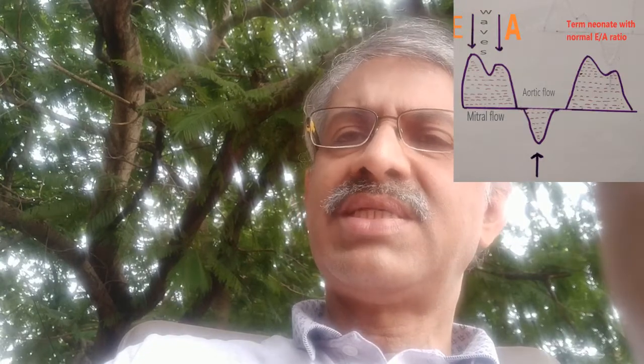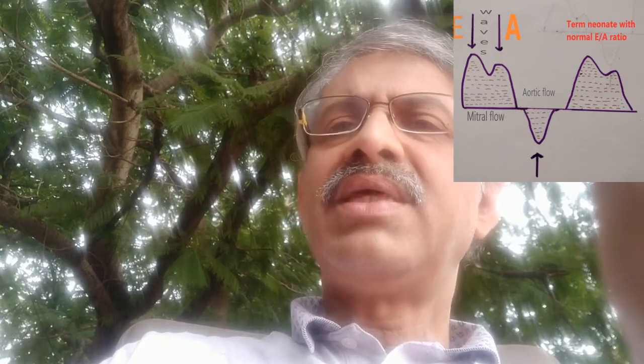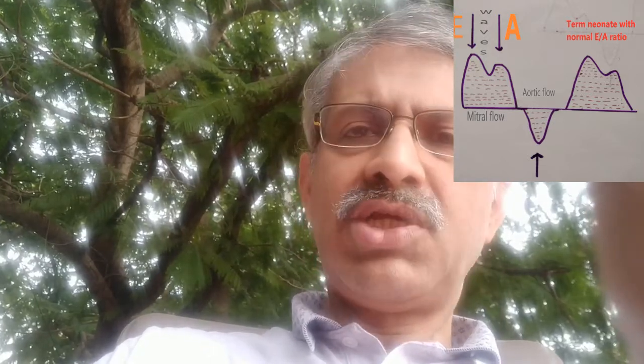In term neonates, because the diastolic function is well developed, the majority of the blood enters into the left ventricle in the early phase. Only a small amount requires the left atrial contraction to push the blood into the left ventricle. So, the E by A ratio is more than 1.